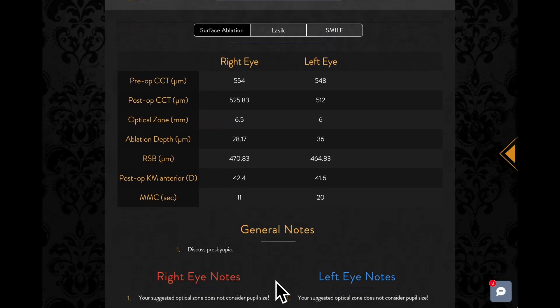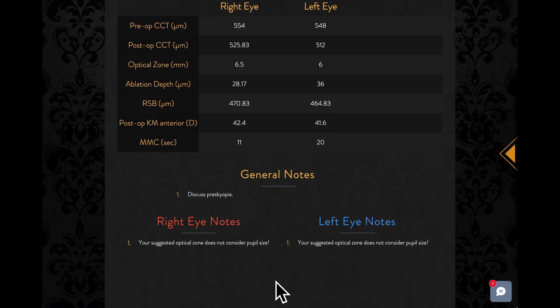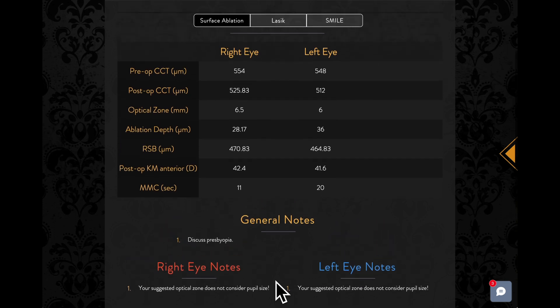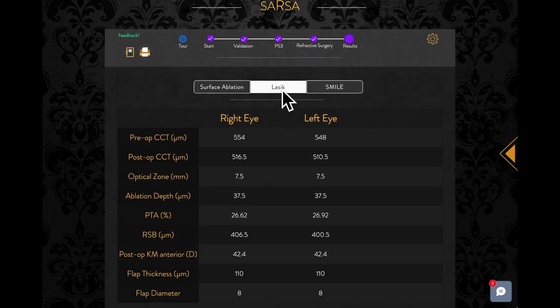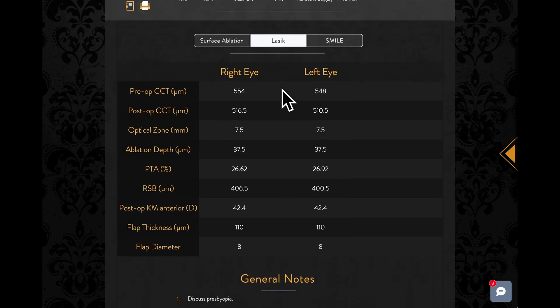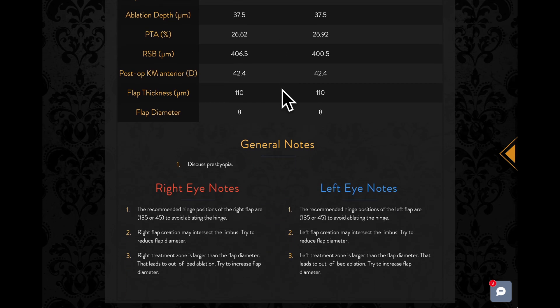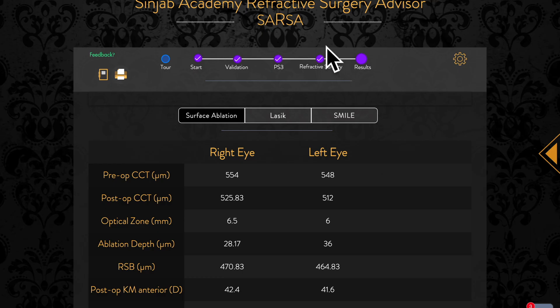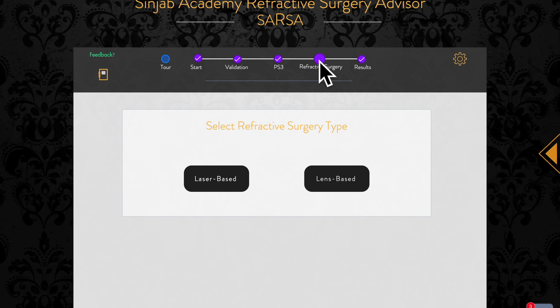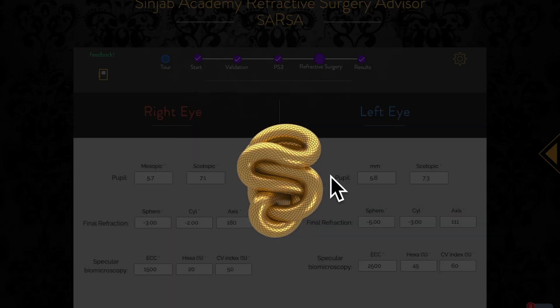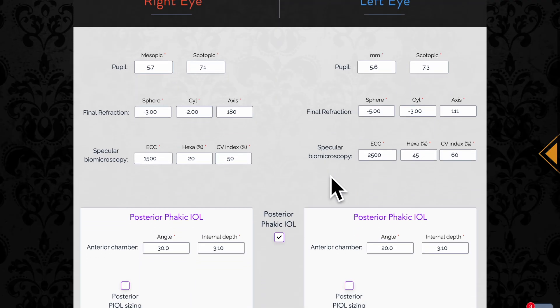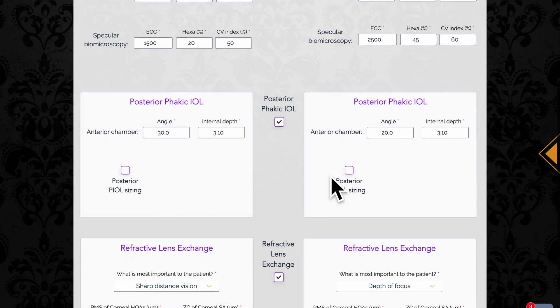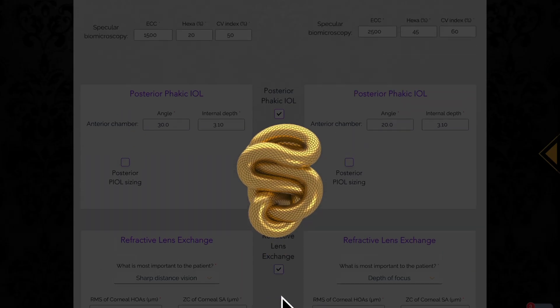The laser-based results will be displayed first. To get the lens-based results, click on the refractive surgery step, choose the lens-based option, and then press get results.